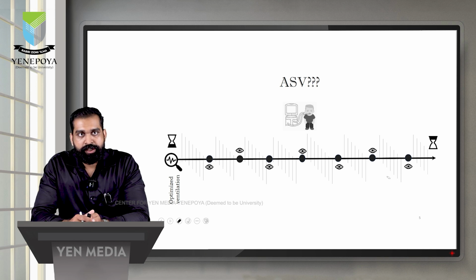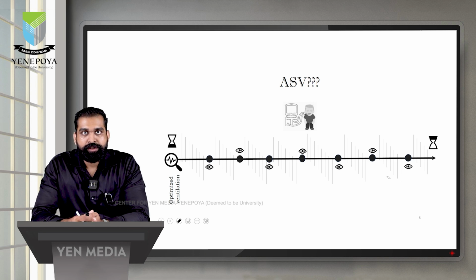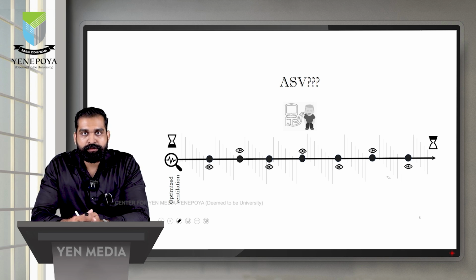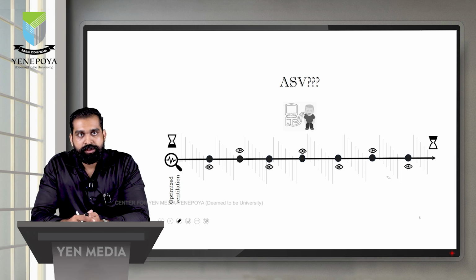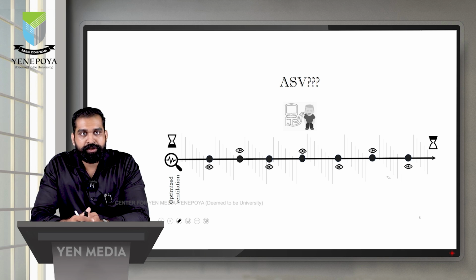Now, the problem with this is that the work of breathing from one breath to the other was never addressed. By bringing in automation into modes of mechanical ventilation, like this mode that we are talking about, ASV, which uses automation, we are able to control the work of breathing of the patient from one breath to the other. So we have a breath to breath control over the work of breathing, and we are able to reduce the work of breathing of a breath to its lowest possible point. Now, eliminating the work of breathing completely is neither necessary nor possible, but we are able to keep the work of breathing of one breath to its lowest possible point.